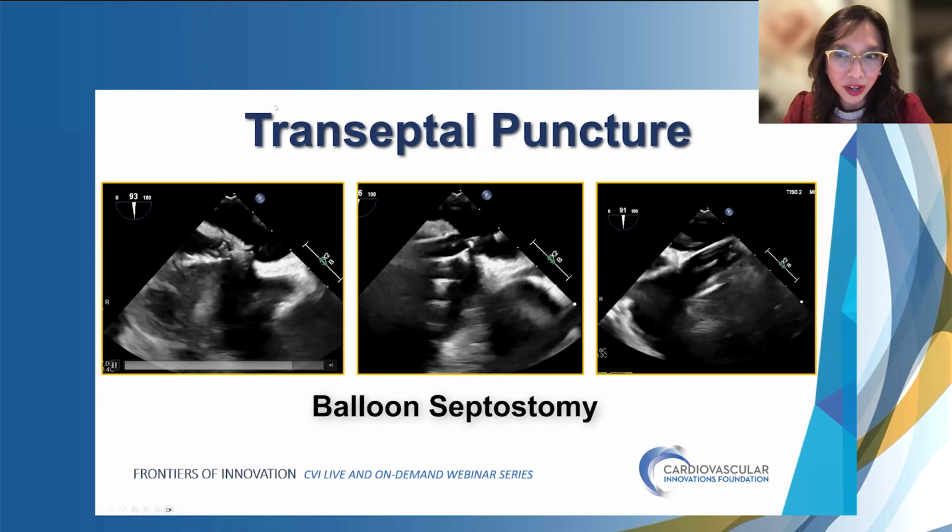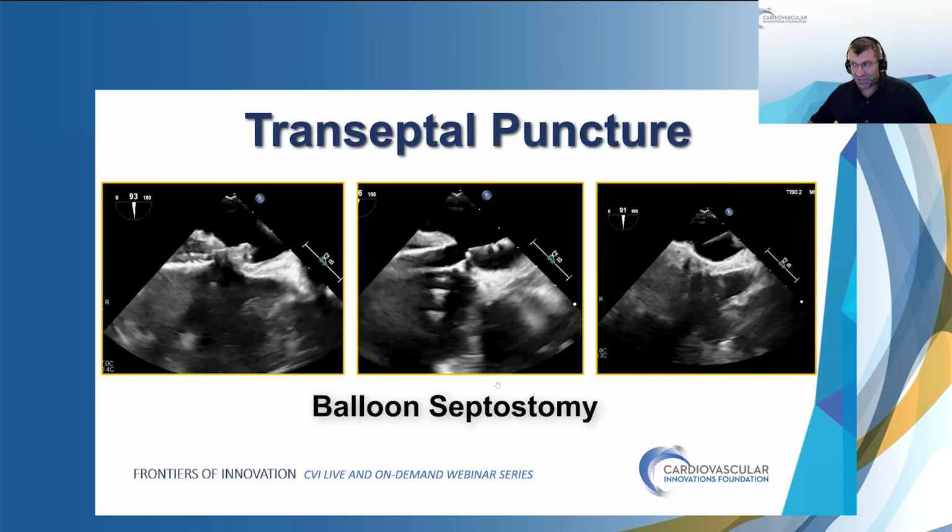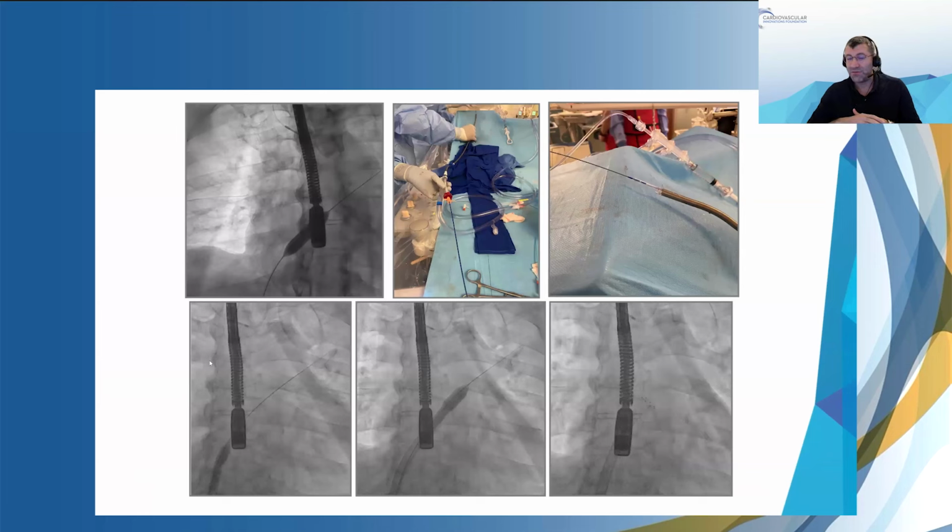And Abdallah provided this next slide as to what balloon assisted tracking is. And so just to clarify for the audience, when we insert the outer cannula with the dilator inside of it, for the 22 French angiovac system, that dilator is significantly smaller so it leads to the catchment of that outer cannula on the septum. So hence the need for balloon assisted tracking like we do for the radial artery to allow for a smooth transition. So this is an example of it.